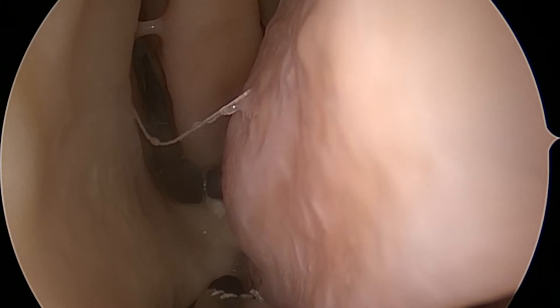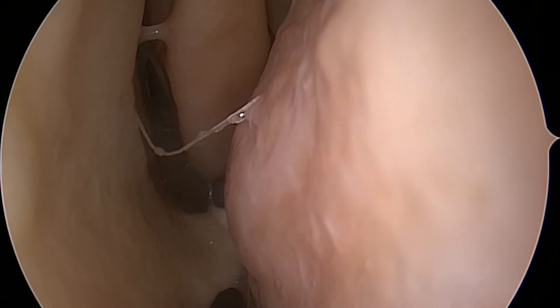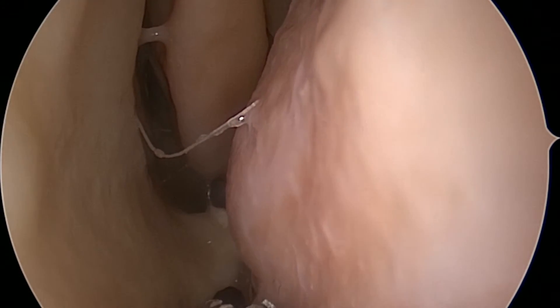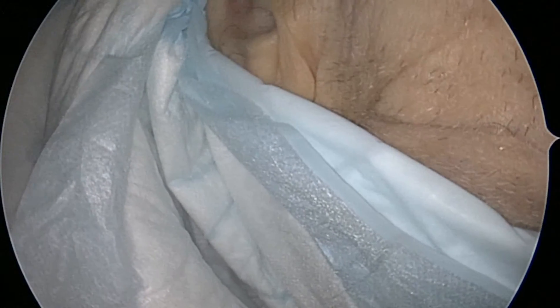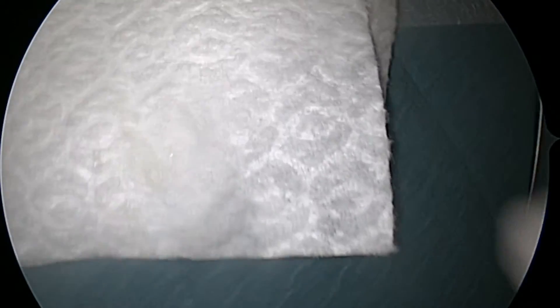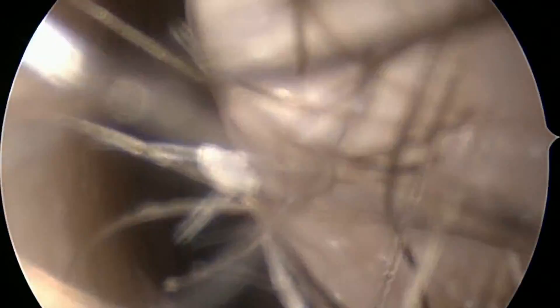We also want to look at the general configuration of the turbinates. Do we have a concha bullosa? Do we have a Haller cell? What is the appearance of the uncinate process and its attachment? It looks like it attaches out laterally. After we've reviewed the CT scan, we can actually proceed with the procedure.